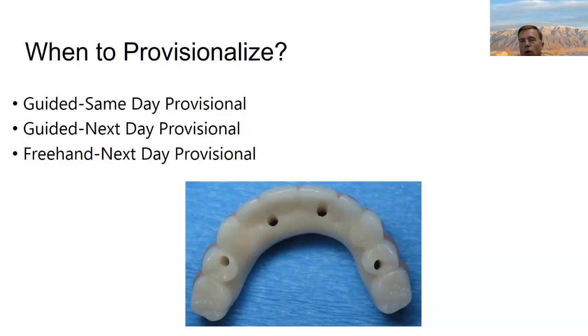With a digital workflow that we're going to be talking about, there's no converting. You screw it in. So that's the good thing. The challenge is that it's very difficult to deliver it on the day of surgery. Even if you have a printer, there's a certain amount of time to design it, print it, wash it, post cure it, and then apply the pink. It's going to take a few hours. And so you've got to either have your patient wait around or deliver the next day, even still.